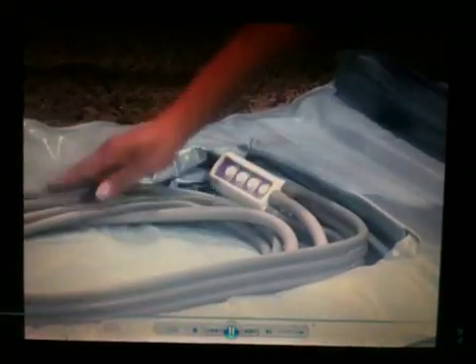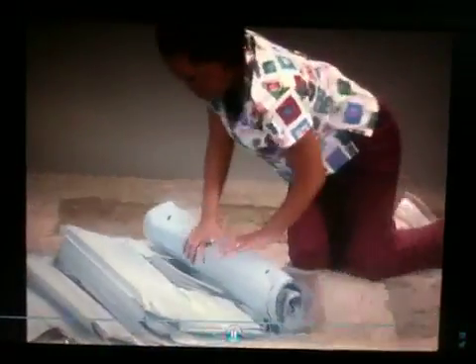Place the four-way hand control in the rectangle on the underside of the lifting cushion and roll the cushion like a sleeping bag. Then return it to the carrying bag. Return the camel to where it is stored.